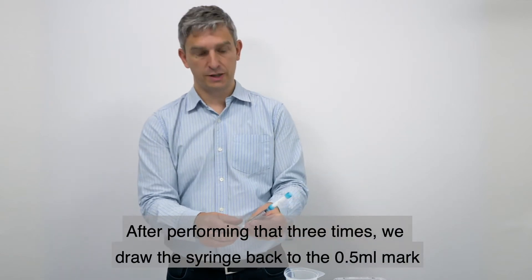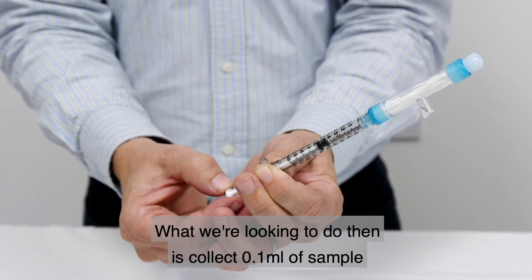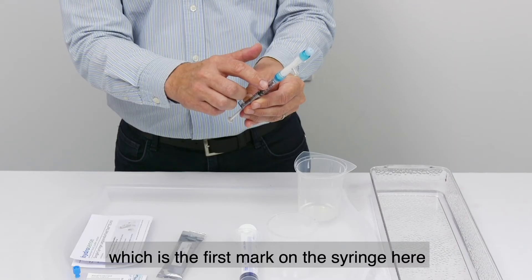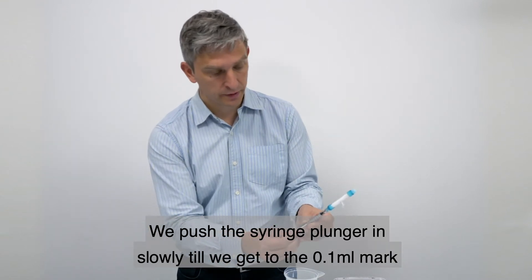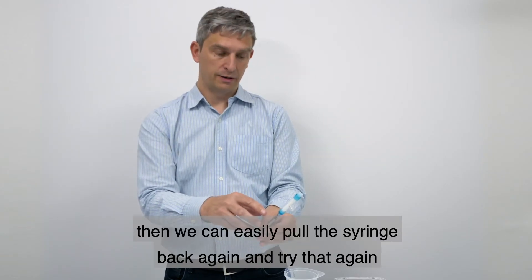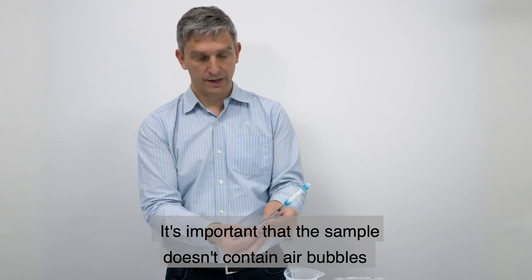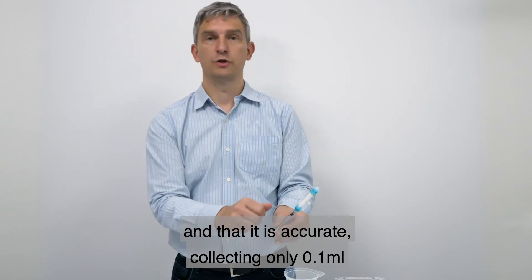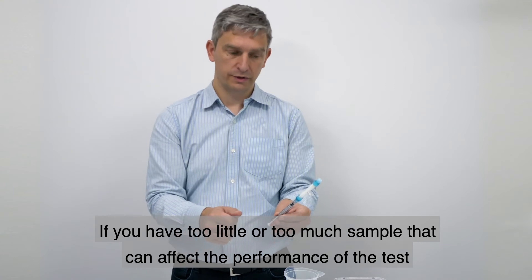After performing that three times, draw the syringe back to the 0.5 millilitre mark, which is halfway down the syringe. We then collect 0.1 millilitres of sample, which is the first mark on the syringe. Push the plunger in slowly until you reach the 0.1 millilitre mark. If there is an air bubble, pull the syringe back and try again. It's important that the sample doesn't contain air bubbles and is accurate at 0.1 millilitres — too little or too much sample can affect the performance of the test.